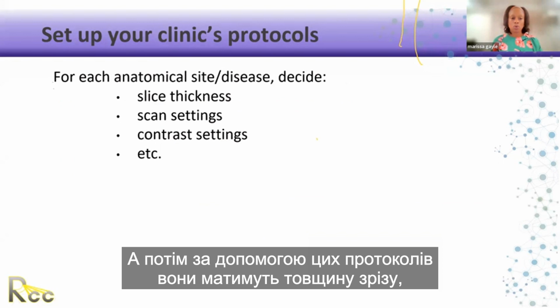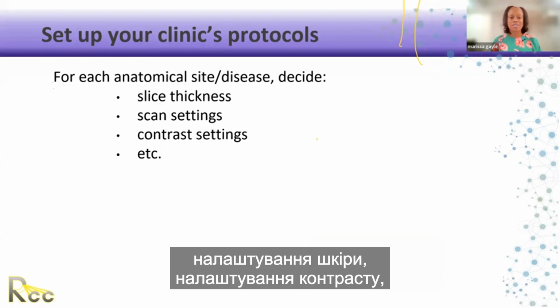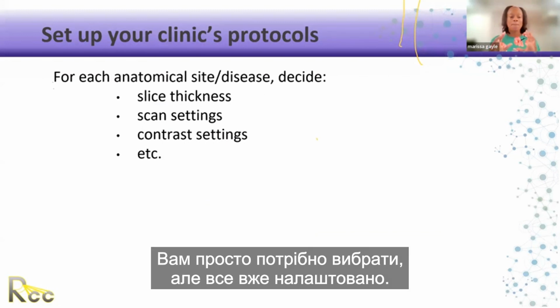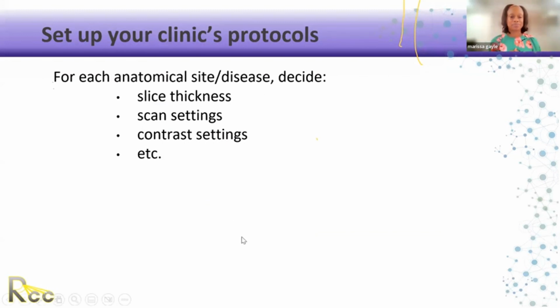And with these protocols, they will have the slice thickness, scan settings, contrast settings. Everything will then be set for the anatomical site and disease. You just have to pick, but it's all preset.